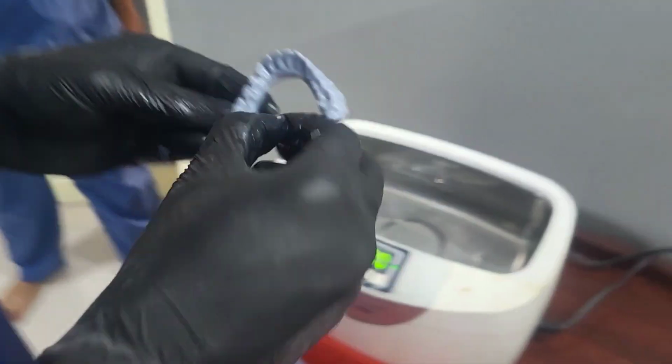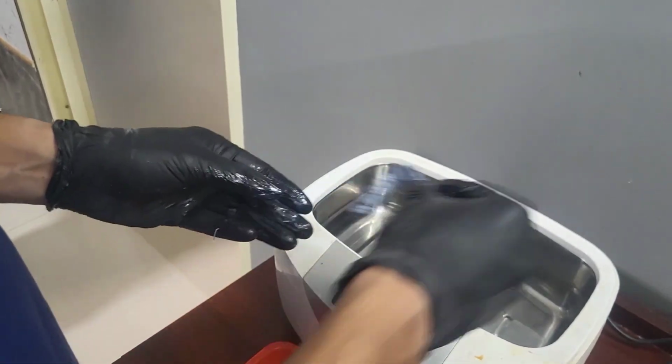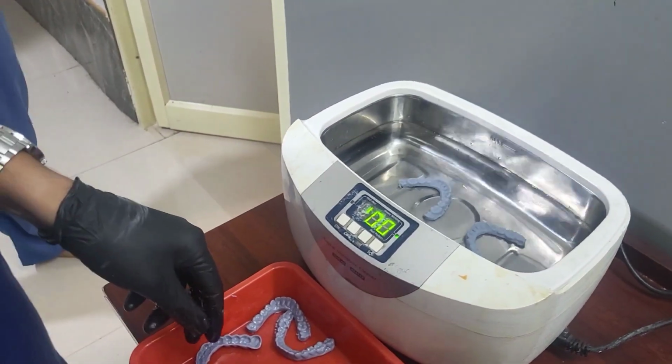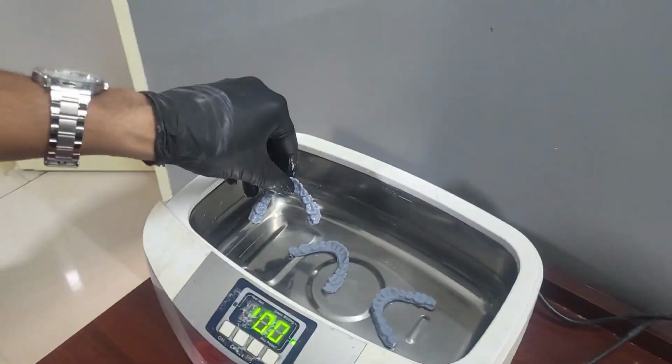And the next step, the residual resin on the models should be removed with the help of this ultrasonic cleanser. We have to keep them in the ultrasonic cleanser containing distilled water for a minimum of 4 to 10 minutes, which is advisable.